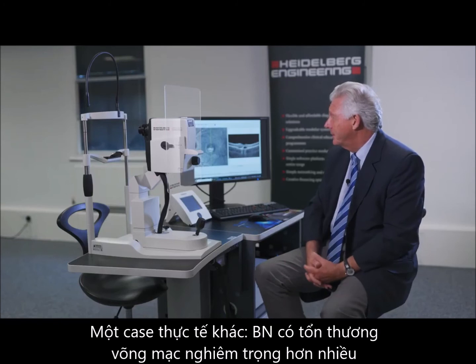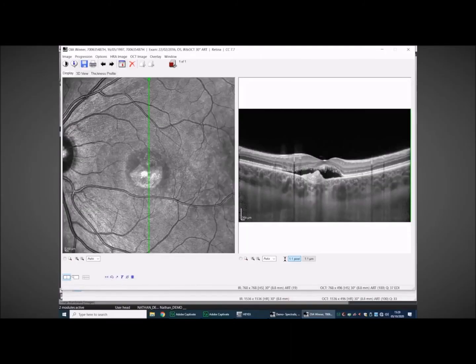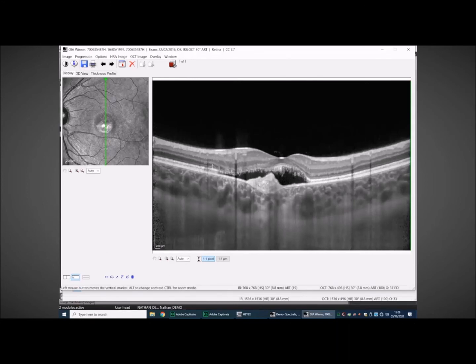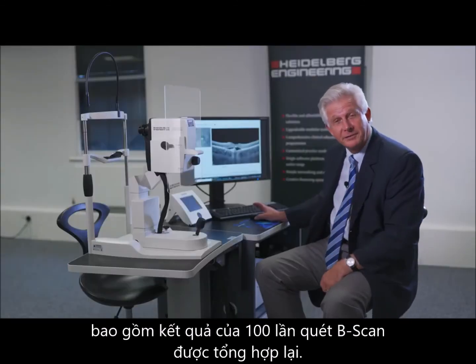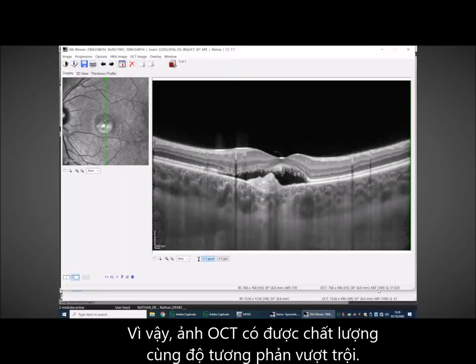So here you can see a patient which is very obviously much more disrupted retina, and of course if we look on the OCT scan you can see why. But notice the detail from the vitreous right the way through the neurosensory retina, all the way through the choroid, right down to the sclera. And this again is another ART 100 image, so we've got 100 individual B scans within our complete image. And that gives us that contrast and detail within the OCT scan.